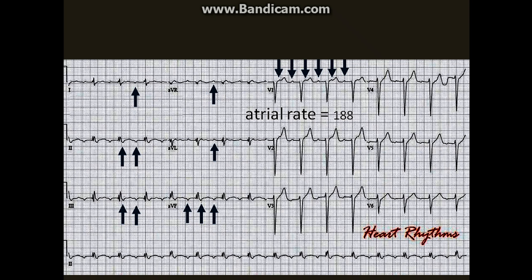Atrial tachycardia can also have a reentrant mechanism, usually seen around a scar in the atrium. The EKG pattern can mimic an atypical non-cavotricuspid isthmus dependent atrial flutter. However, neither rate nor lack of isoelectric baseline is specific for any tachycardia mechanism.